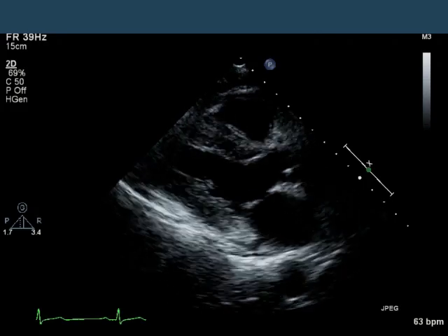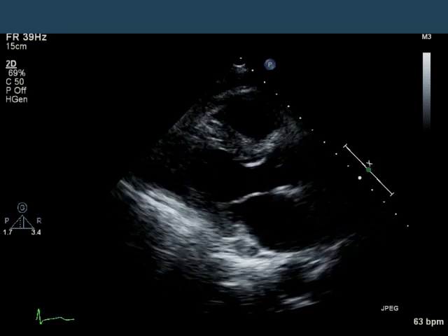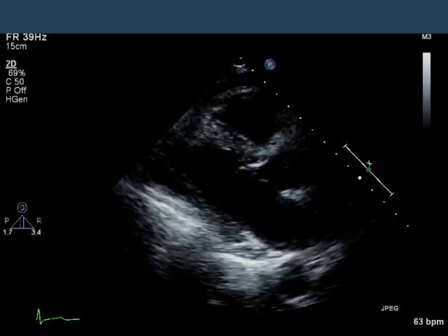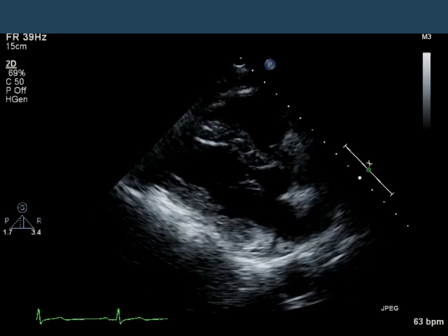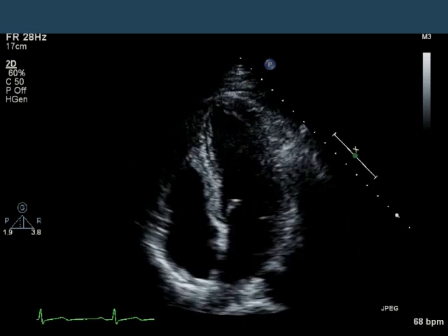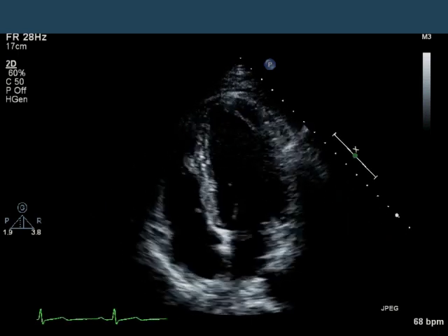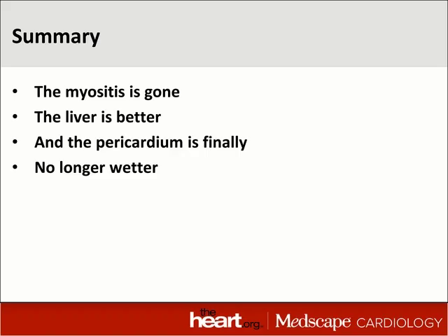Here's a repeat echocardiogram, eight months later. The patient did not have any procedures — no needles were stuck anywhere. Here's a parasternal long axis — same patient, no effusion. Apical four-chamber in the next slide: normal LV, normal RV, no effusion. So, in summary: the myositis is gone, the liver is better, and the pericardium is finally no longer wetter.